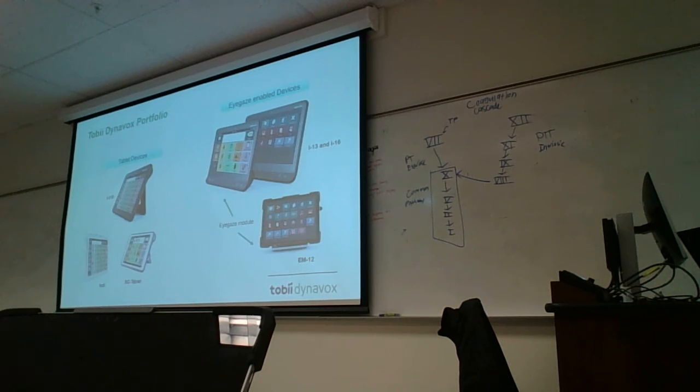And the devices on the right here, you have the new i-series, so the i13 and i16. The i13 came out in October of last year, so that's our latest product. There's a brand new eye tracker in there, and like I said, it has that partner window on the back. The buttons that you see on the front of the device have functions that could be programmed for touch access. So as a caregiver you could pause, put up the track status, or turn the volume up and down. And the buttons are also eye gaze accessible, which is nice. If you have users that want to raise the volume, they could just look at the button and it activates.